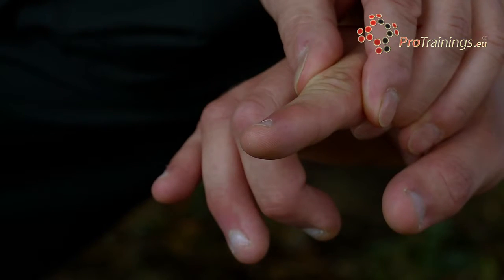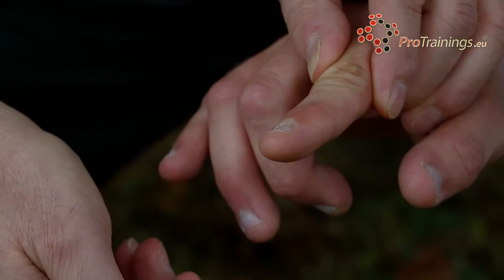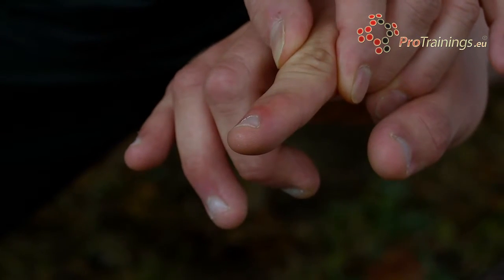One thing we can use very quickly to check that is cap refill. By squeezing the finger and allowing the capillaries to refill with blood, they should refill in under 2 seconds. If it's over 2 seconds, there is a restriction in blood flow which may affect the pulse oximeter. Also the colour of the finger. Is there any cyanosis to the fingertips, which is already showing us there's an oxygen problem? Can we see those before we put the pulse oximeter on?